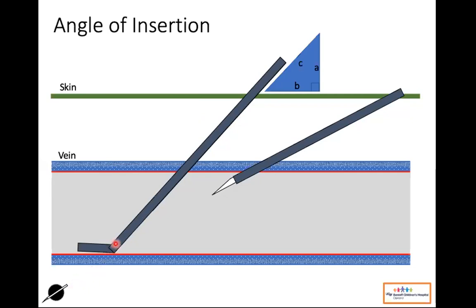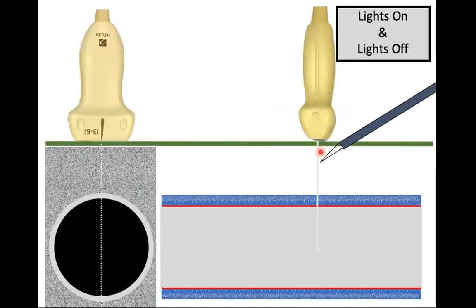So we can start our angle into the vein at a relatively steep angle, and then we can shallow out. Because when we shallow out, let's say we get in there, and then we're advancing our catheter off at that angle, it's nice and smooth. So be thinking about changing our angle as we go into the vessel.